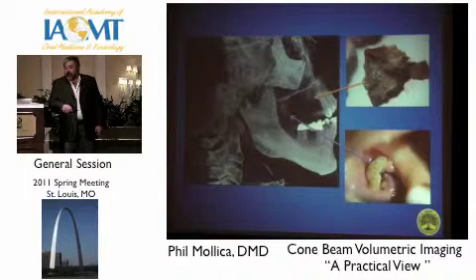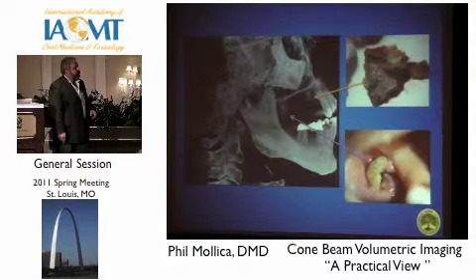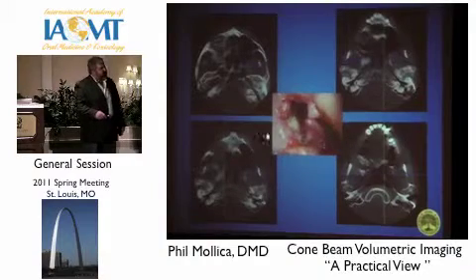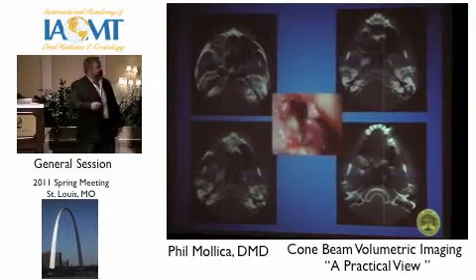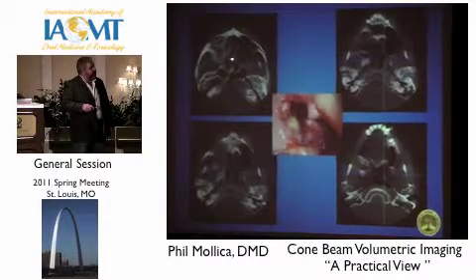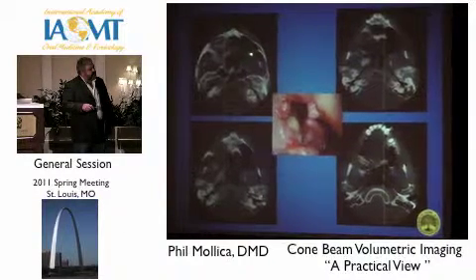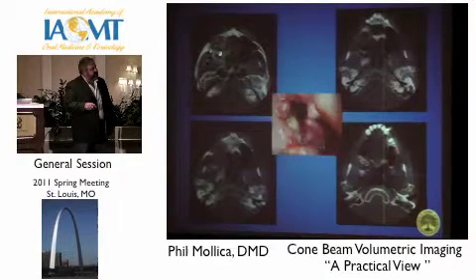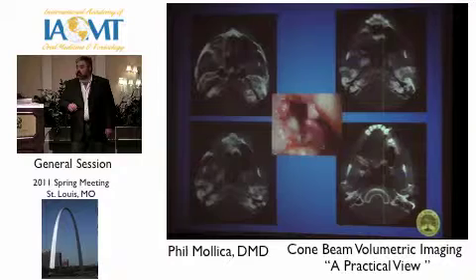Now, how do you monitor it and so the extent of it? Well, you have to visualize this. Once again, with our multiple imagings, as the healing process goes on, this is where that distal aspect, that hunk of bone was sticking out on the distal aspect of the maxilla. You can go through sectional views, go up and down and see his entire, if you see this here, is his maxillary sinus, okay? Over here on the side of the insult, which is his right side, it's totally obliterated. There is no maxillary sinus.